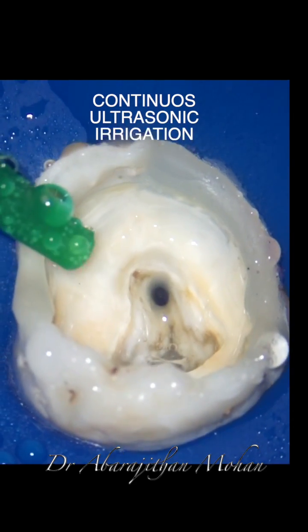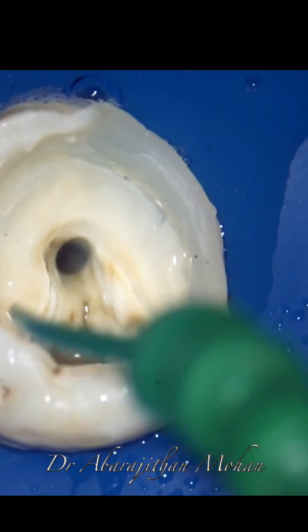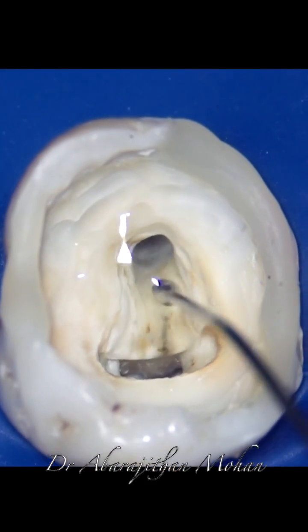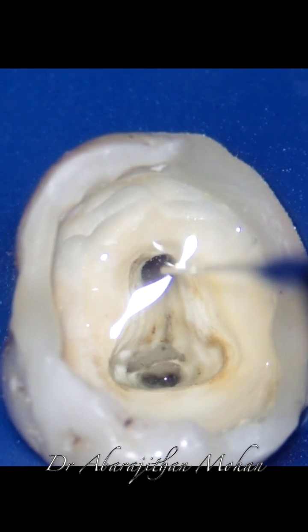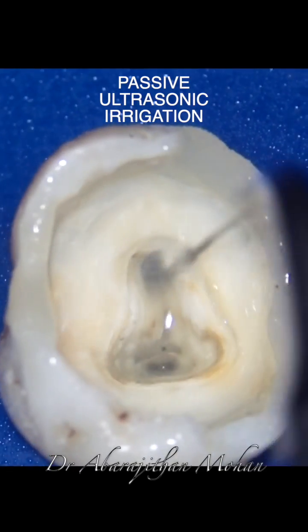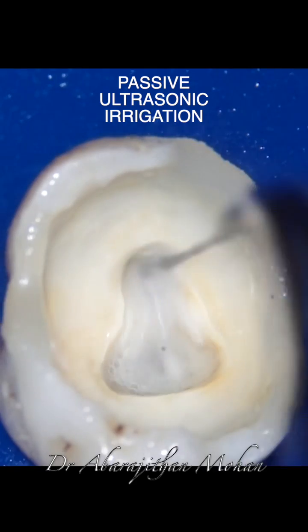Following this, it can also be used for passive irrigation or irrigant activation that we usually perform with endoactivators — by filling the canal passively with sodium hypochlorite and then using it in a dry mode to activate. And you can see how efficient it is even for the activation.